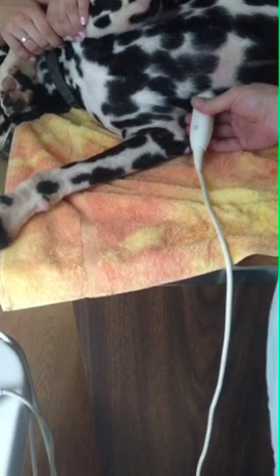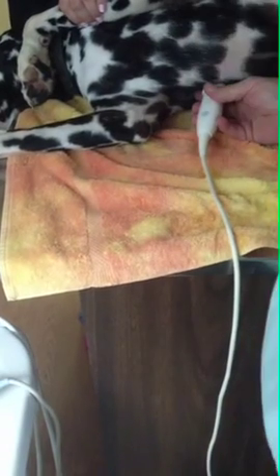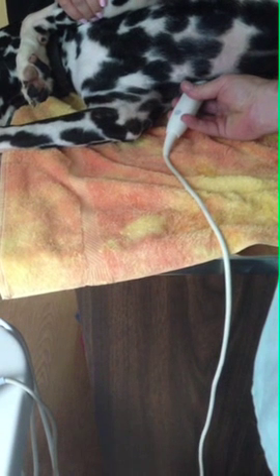The first maneuver is to use the finger to collapse the lung. We will move the front leg forward. The angle of the probe is going to be pretty much parallel with the angle of the tricep.